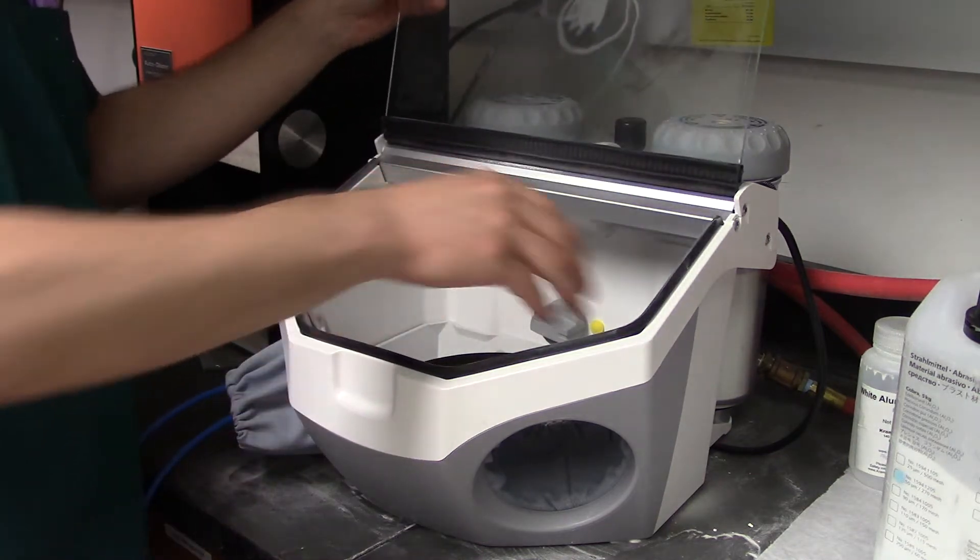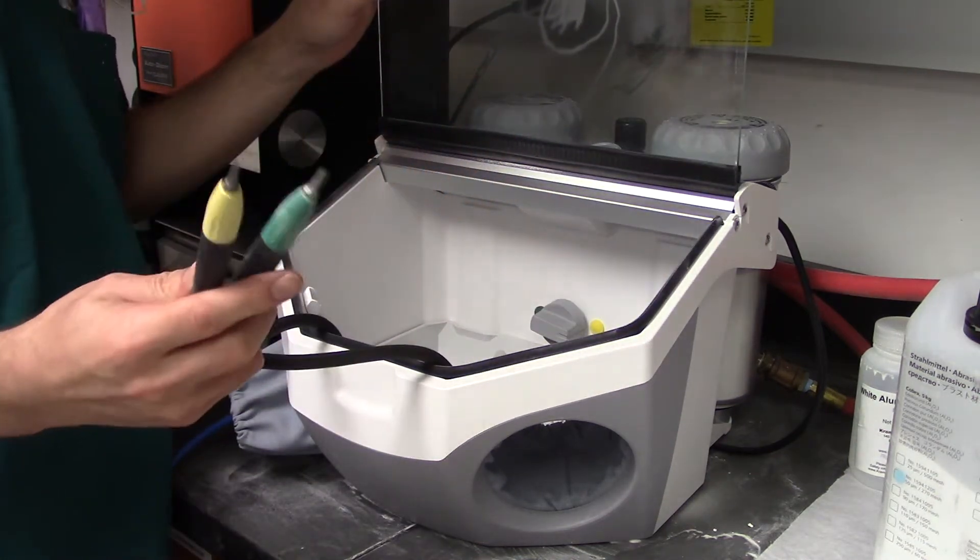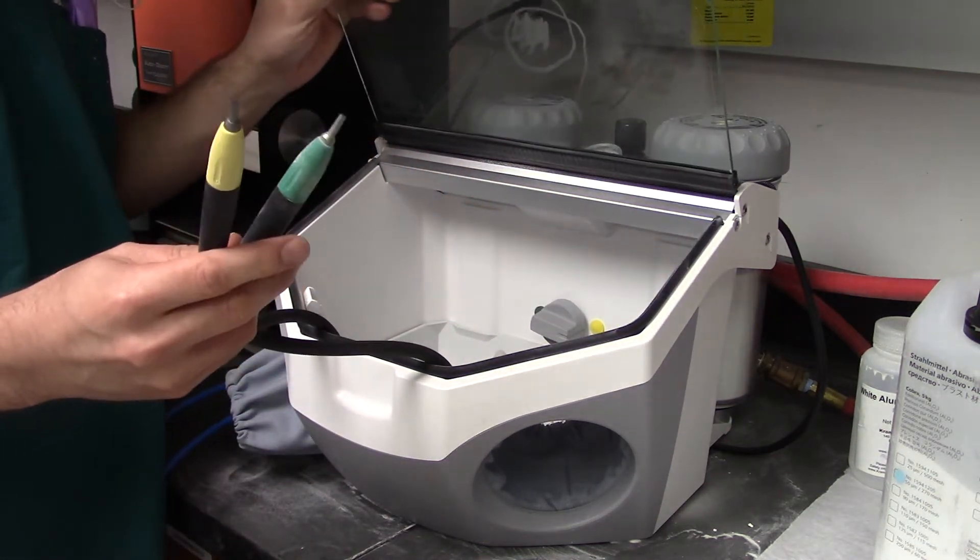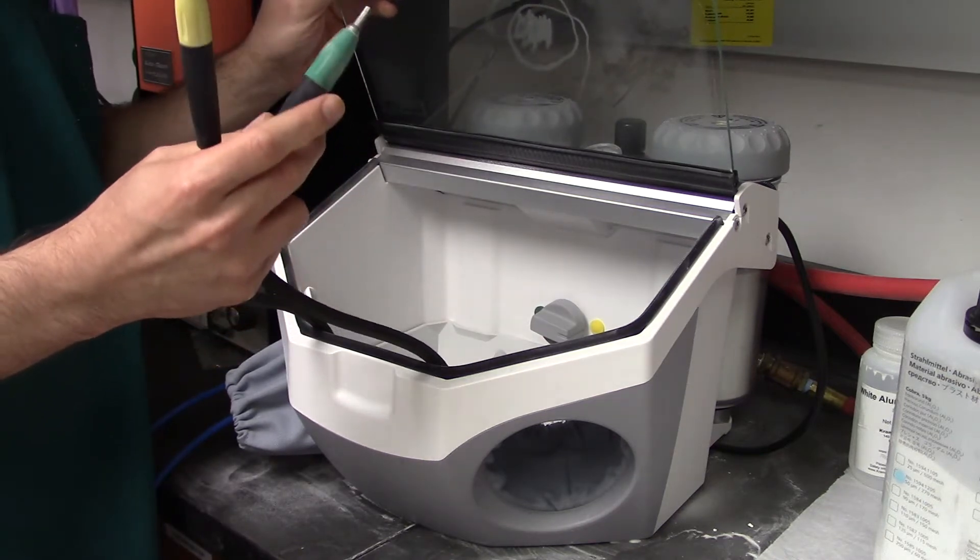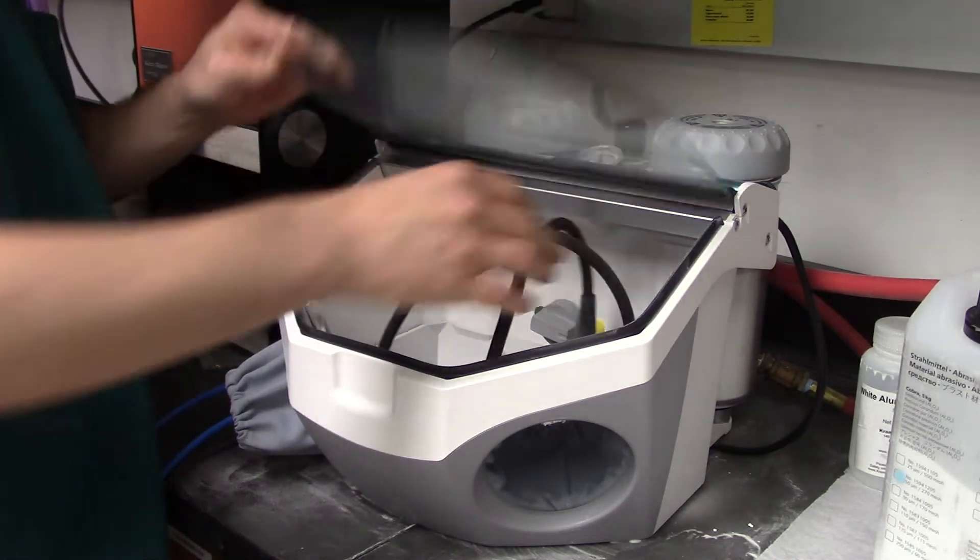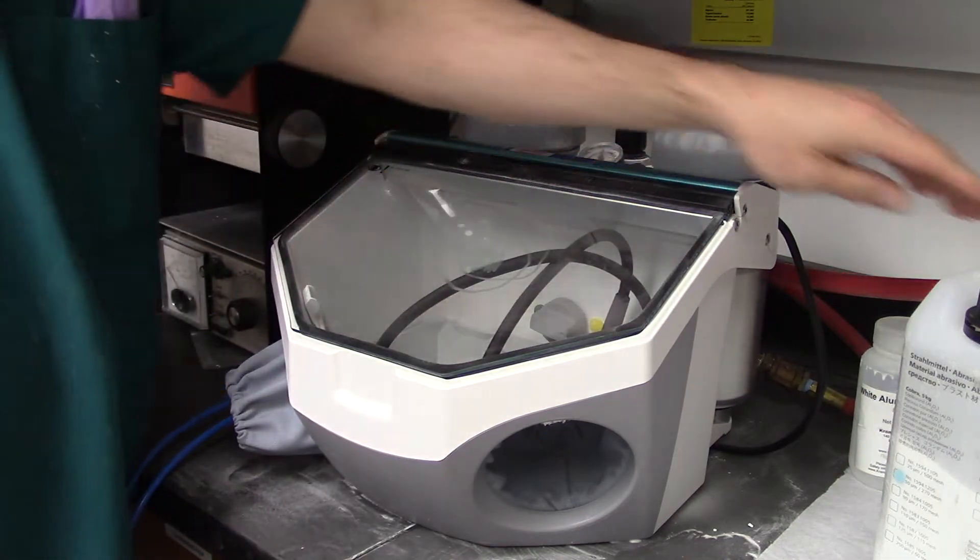And inside of the box, we've got two different nozzles. We've got a green one and a yellow one. So the yellow one again is for glass and the green one is for alumina particles. And when they get empty, we can replace them.